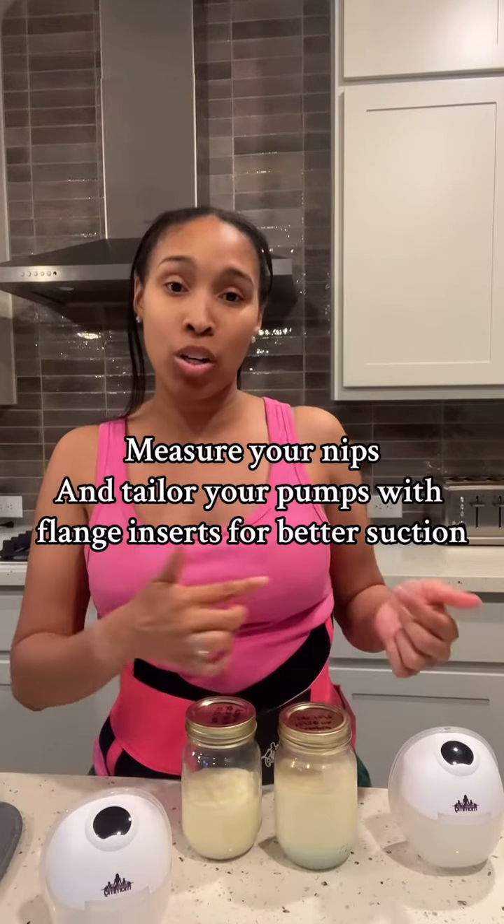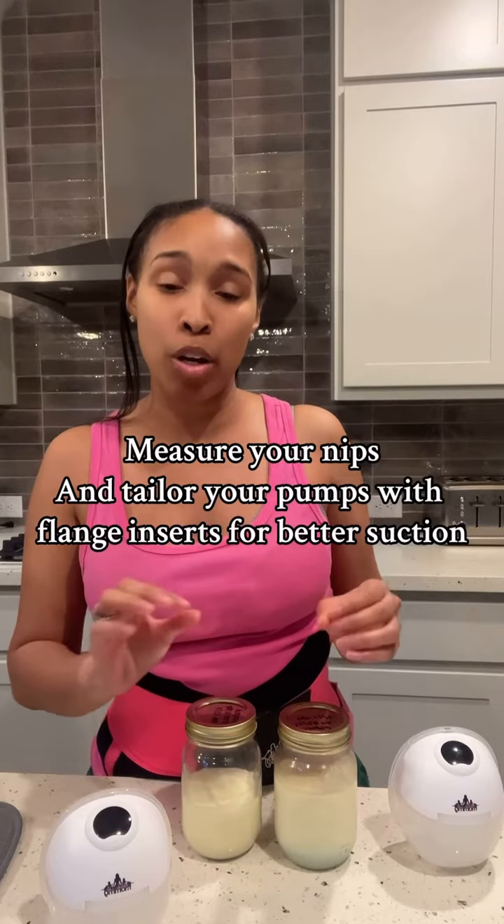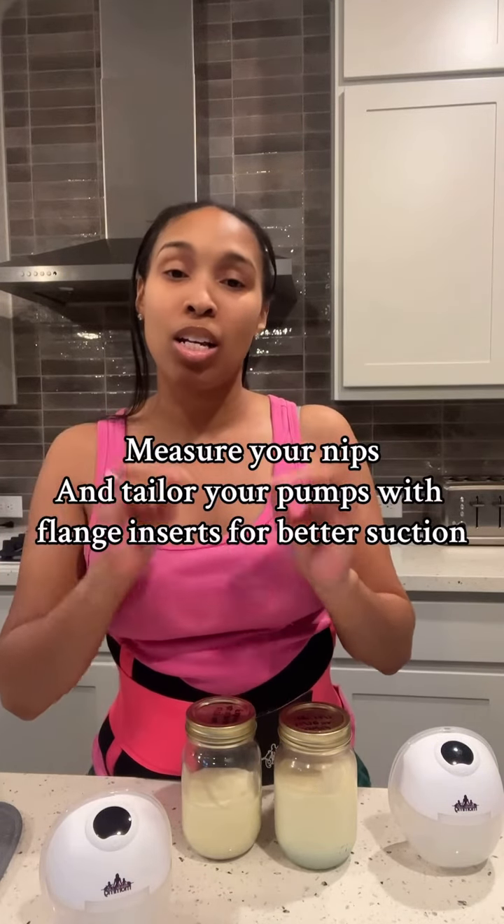If you are a pumping mom, you want to make sure that you're using a nipple size card to measure the circumference of your nipple, and then using flange inserts to make sure that you're eliminating the air pockets and eliminating gaps. That's going to make sure that you're getting that strong vacuum suction that you need to stimulate another letdown.